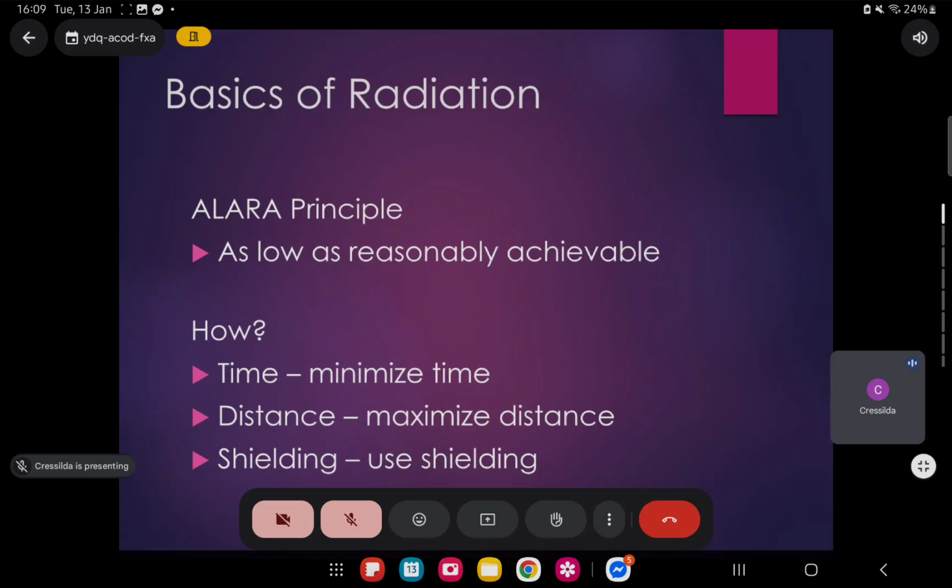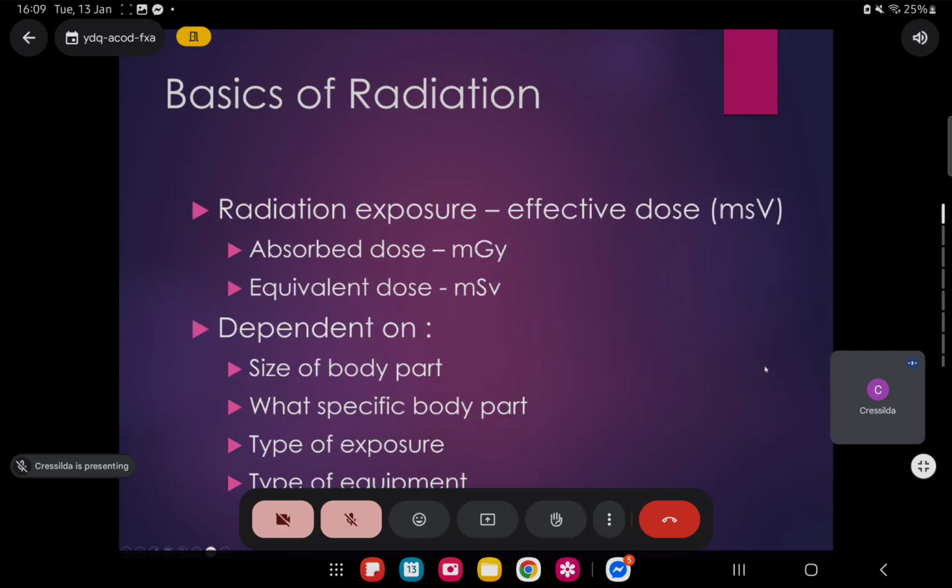This is also one of the most effective forms of protection. It will depend on what kind of radiation the source is emitting. I won't go into detail, but enough to say that if there is available shielding, whether it be a lead gown, goggles, or a thyroid shield, always use it. It is significantly lighter now compared to way back before, when it was significantly heavier.